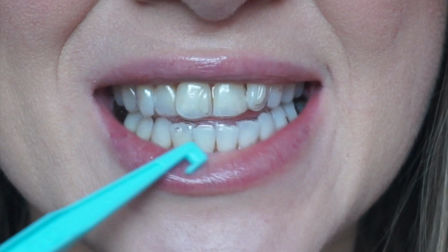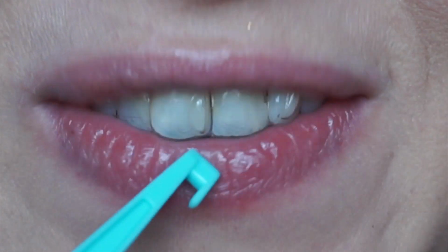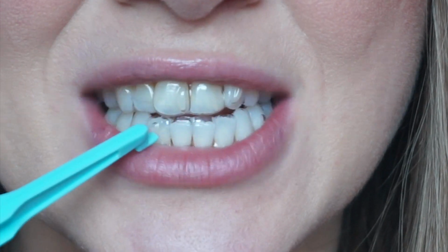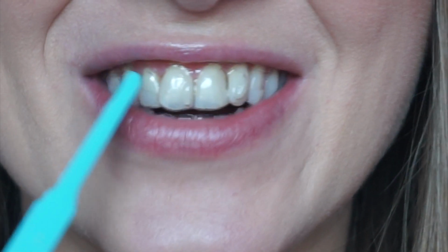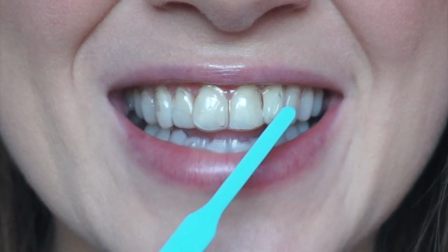This is from the older set of aligners. They don't fit as good because it's from the older set that I've been naughty with, but Julie thought they still fit pretty good, and it looks like this tooth is on the right track, and they fit pretty well compared to how the upper ones did. And they just changed the plan for the upper ones recently, since I've been behaving badly with wearing them. So that's why these fit so nicely on my teeth. And if someone doesn't know I'm straightening my teeth, they wouldn't even notice.